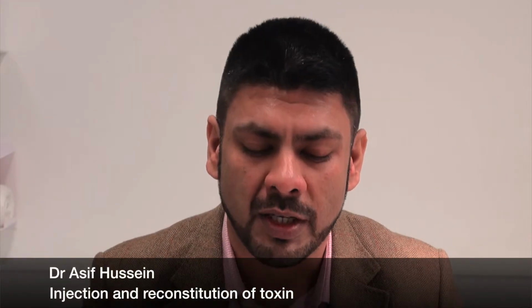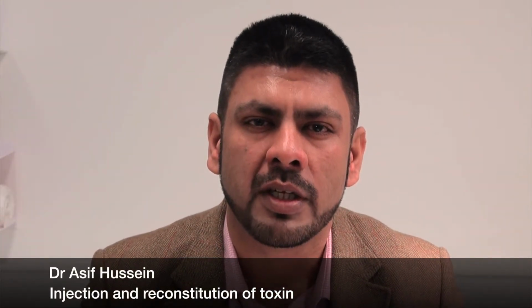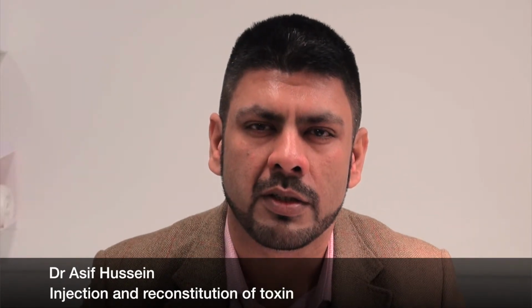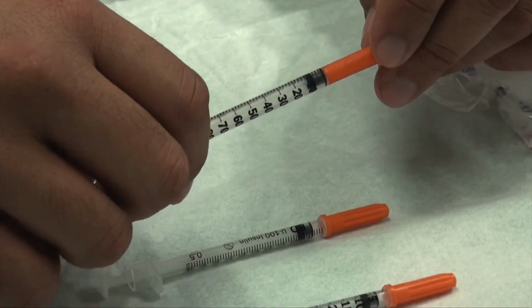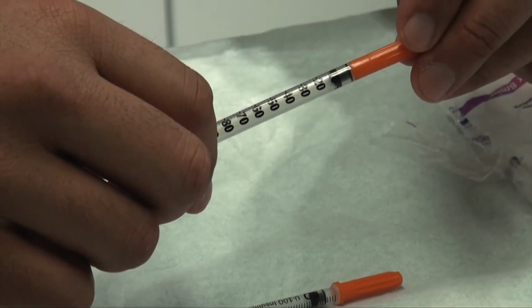I would like to start by showing you the three types of insulin syringe that I usually use to administer toxin to clients. There are three variations: a 0.3 ml version, a 0.5 ml version, and a 1 ml version. Now, the 0.3 ml version I will leave for another time.